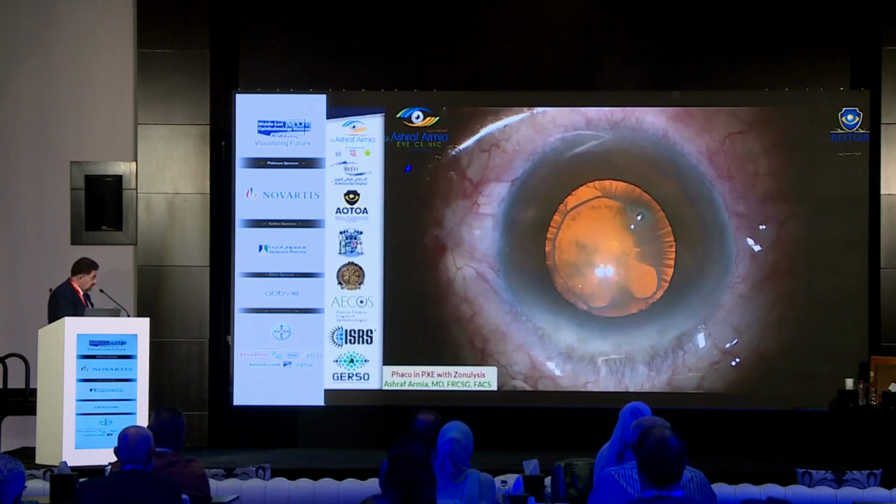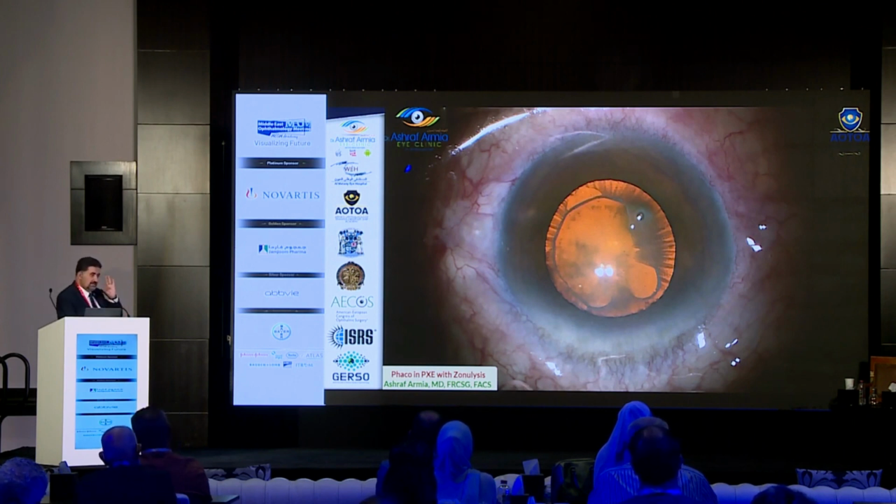So, this case is severe pseudoexfoliation. This is not a regular pseudoexfoliation. It has a severe exfoliation on the anterior capsule, and when you see this mark on the anterior capsule, it means highly affected pseudoexfoliation. And the papers in the last 3 years found that corneas with pseudoexfoliation have poor endothelial count, and they are prone to decompensate easily. So you should protect your cornea in these cases.